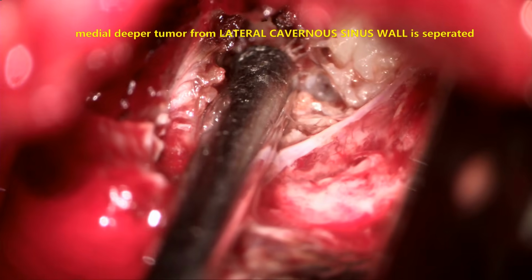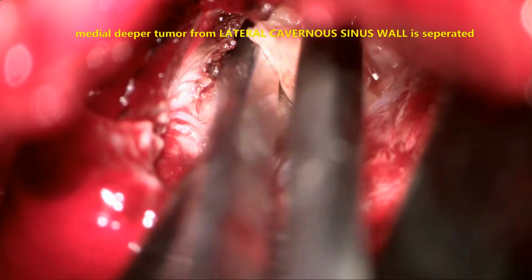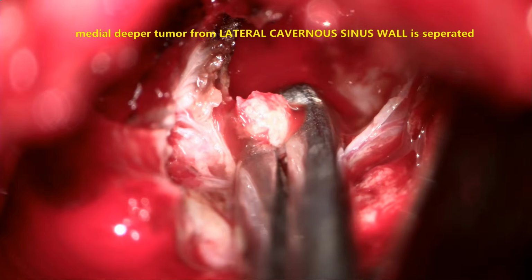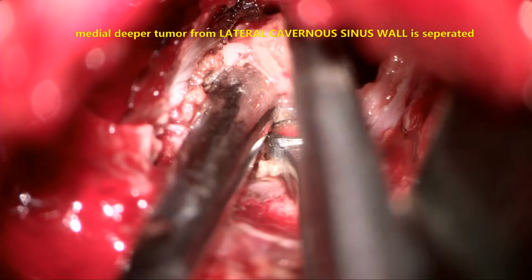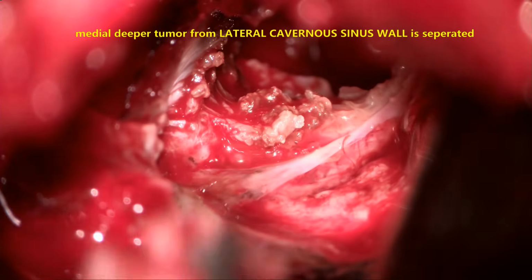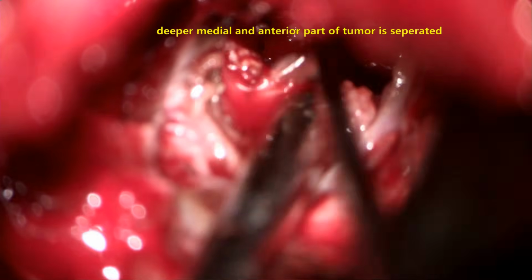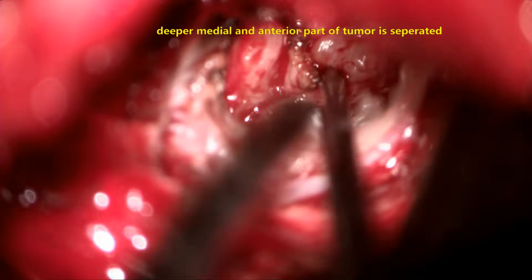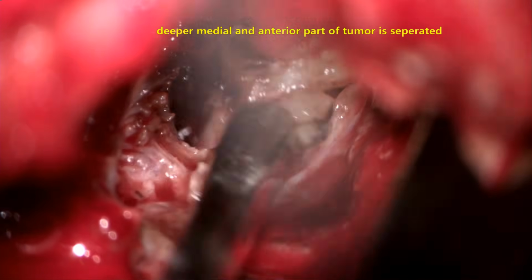Now the debulking is done posteriorly and inferiorly and the tumor is removed. You can see the posterior part of the tumor from the ganglion where all three nerve roots originate. Superiorly and medially, the first division, that's ophthalmic; in the middle and inferiorly, the second division, maxillary; inferiorly and laterally, the third division, that is mandibular.